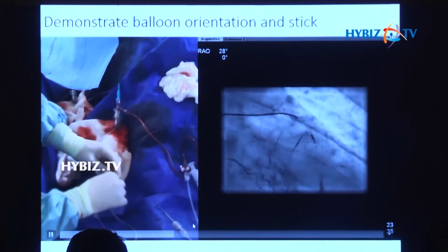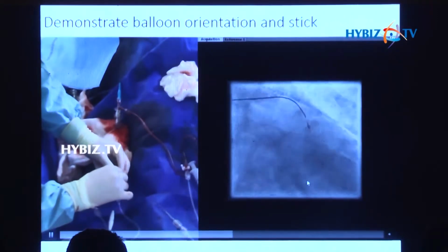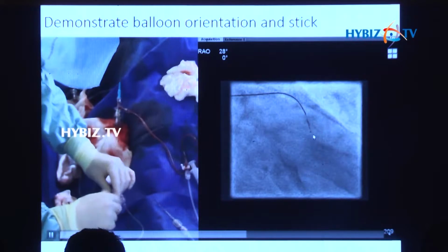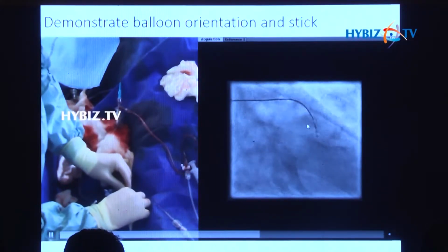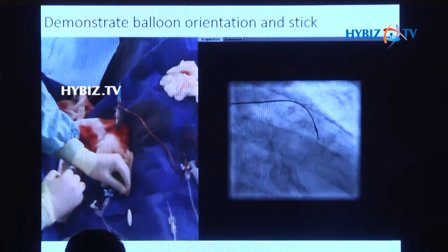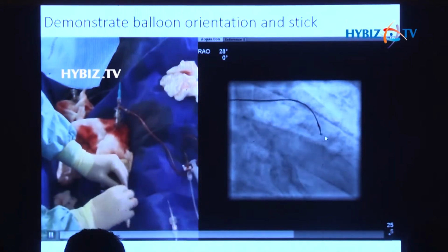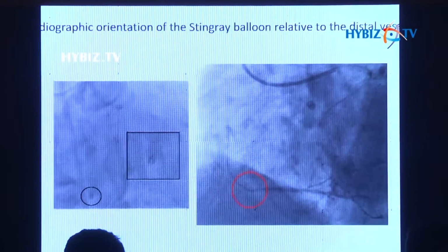So I'm going to skip the video to the juicier sections. There it comes. And the distal hole will continue in the subintimal space. One hole goes to the adventitia, and one hole goes to the true lumen. And here we know by retrograde angiography which hole to take, right? So it's the one on the left. And once you make the stick, you're going to do what's called a stick and swap.